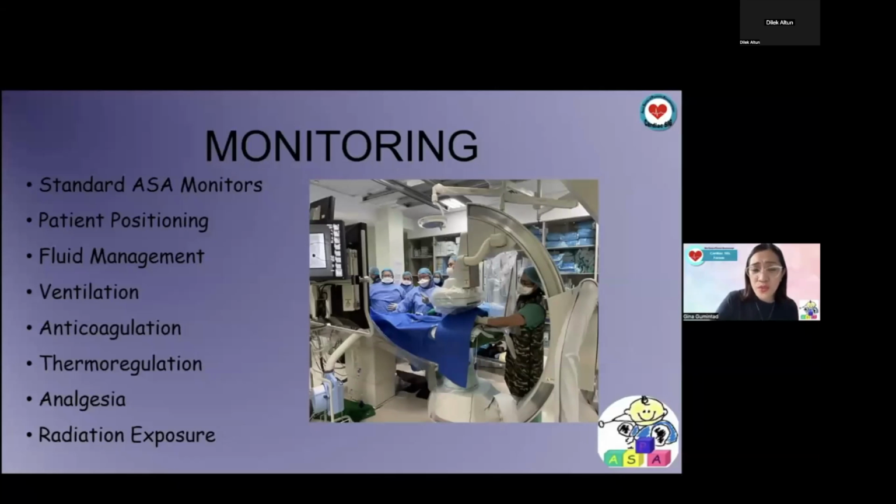So very crucial also is patient positioning. We need to meticulously position our patient and set up to ensure that adequate monitoring is in place. So establish secure IV access. Equipment is oriented in a way that it will not disrupt the procedure. So you need to really check on where the equipment is placed so that it cannot disrupt the full conduct of the procedure. Sometimes we place the hands of the patient above the forehead, but we need to be very careful in positioning patients like this to really check that there will be no brachial plexus injury.